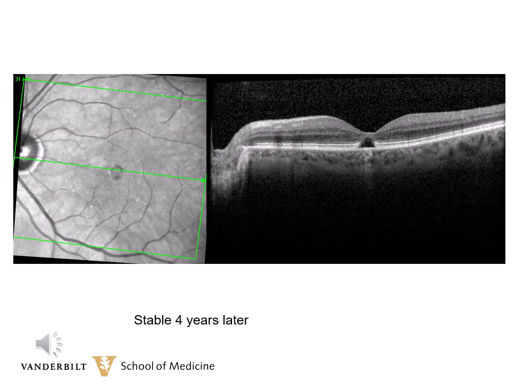This is her OCT. You can see very well that there is a dehiscence or a change or a hyporeflective area in the outer retina. There's also somewhat of a flattening of the foveal depression as well.